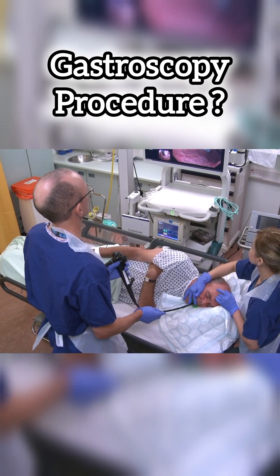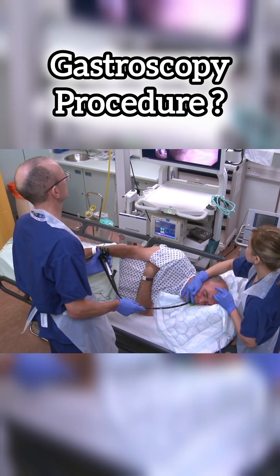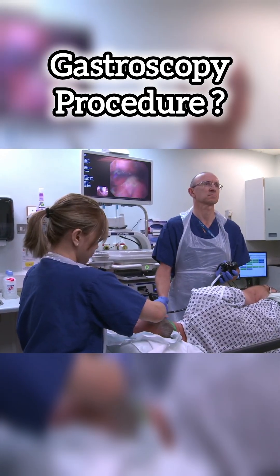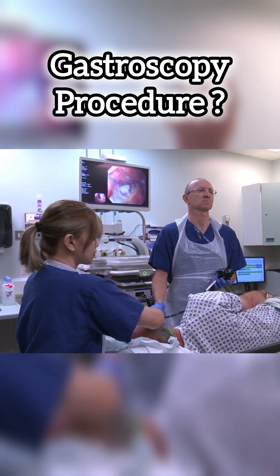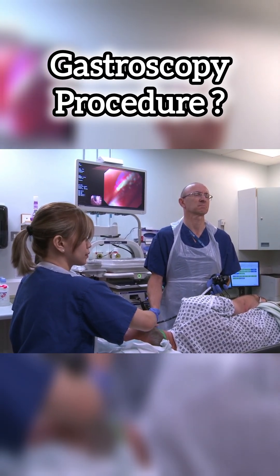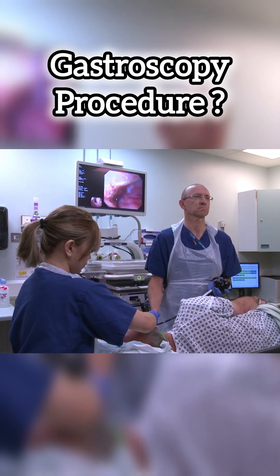Any problem areas will be photographed and a biopsy may be taken. A biopsy is a painless procedure that involves taking a small sample of tissue from the lining so that it can be later examined under a microscope.